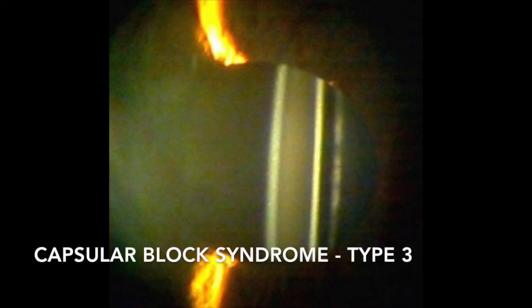In addition, in this patient we can see a type 3 capsule block with a clear zone between the intraocular lens optic and a clear posterior capsule.